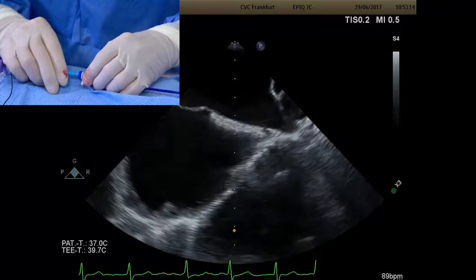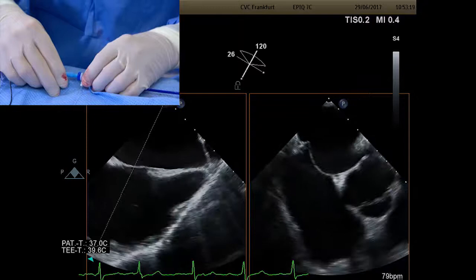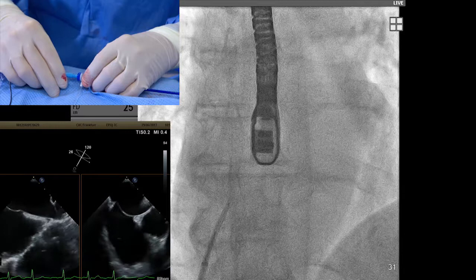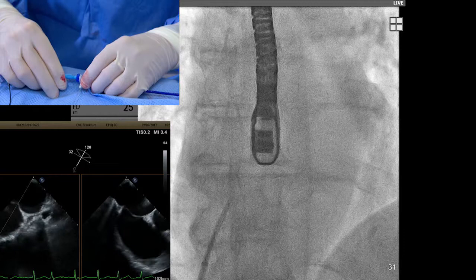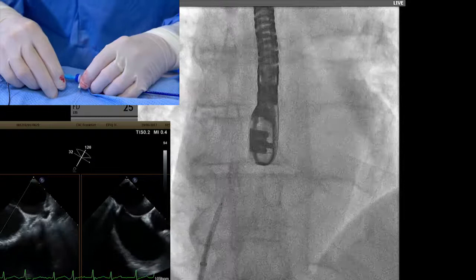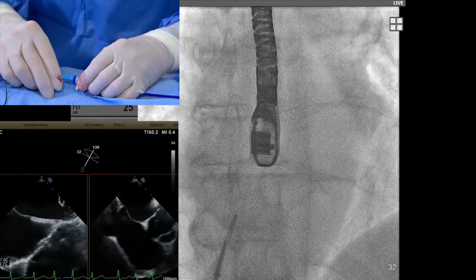Checking the long axis view — still very high. Coming down a little because we want to go to the fossa, but currently quite posterior. On the short axis we can see the position. Checking the long axis again — the needle is still superior. Going a little bit more anteriorly. Confirming on long axis — we are now inferior. This is a good position to proceed.